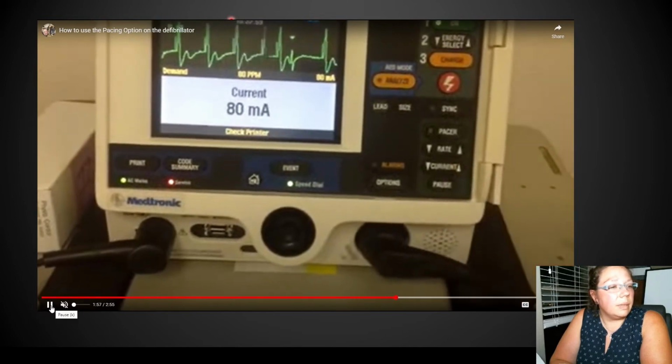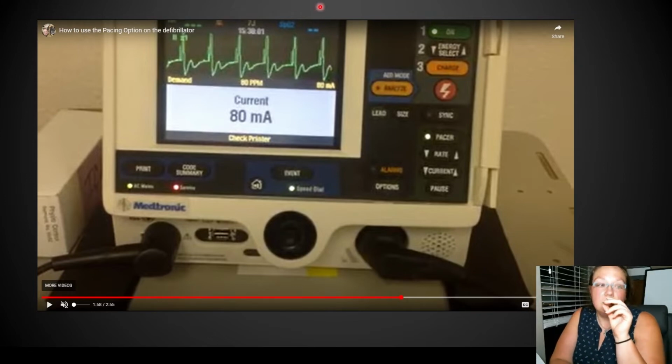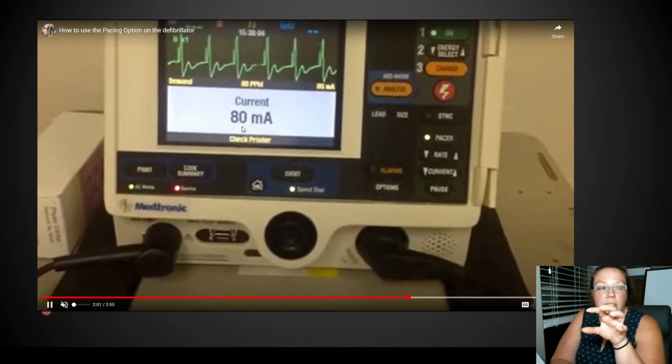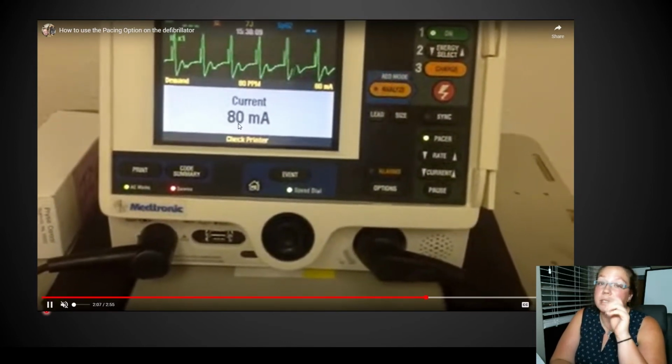let me see if I can stop it at a better view. Okay. Each of these pacer spikes now has a QRS. That means that you are sensing, you are capturing, your heart is capturing those electrical impulses and contracting. Depolarizing, contracting because it depolarized, and it's pumping blood at a rate of 80. Each pacer spike should have a QRS. So that is what happens when we start getting the heart to capture that electrical impulse from a pacemaker, whether it's temporary or permanent.